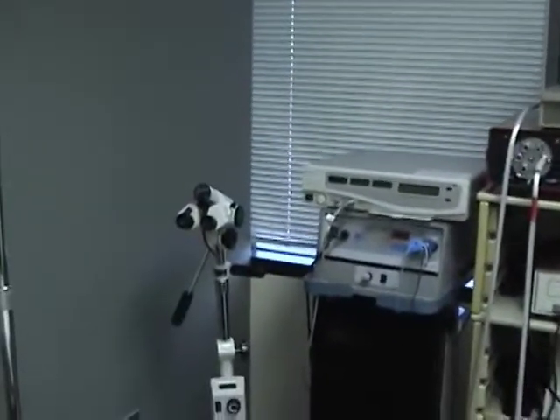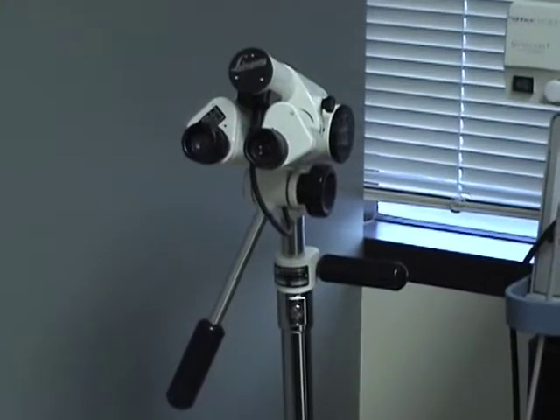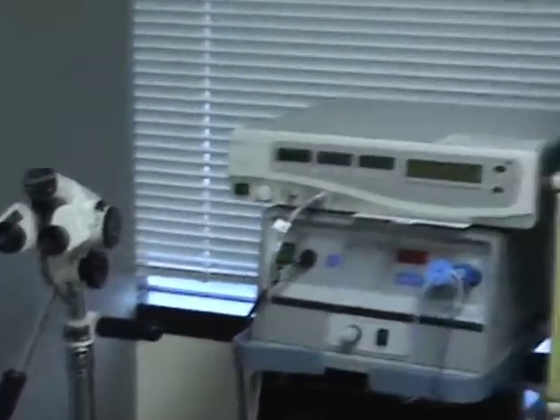And then the last piece of equipment over there is called the colposcope, and it's used for our colposcopy procedures, and those are done basically to have the doctor have a better look at the cervix. So she cleans off the cervix and then puts a different solution on, and then through the scope, the microscope, can see which cells possibly have some precancer or other cellular changes, and then she can do a more accurate biopsy or sampling of those cells, sends them off to pathology, and then does follow-up treatment after that.